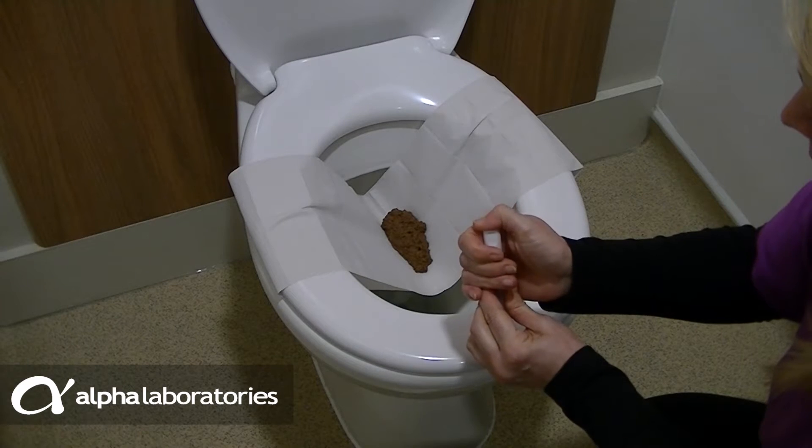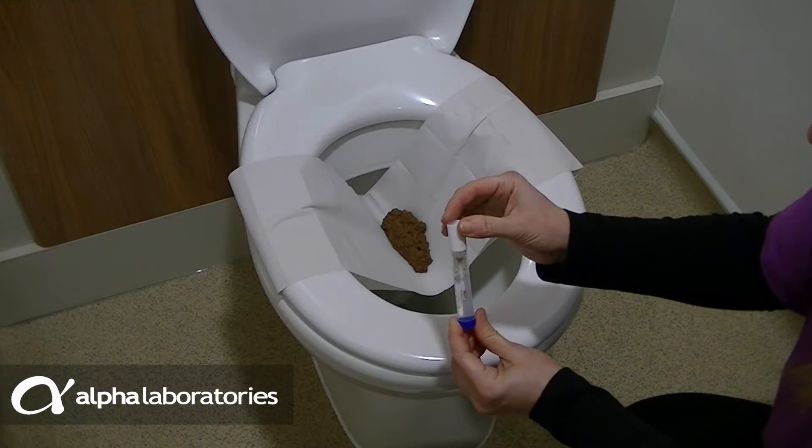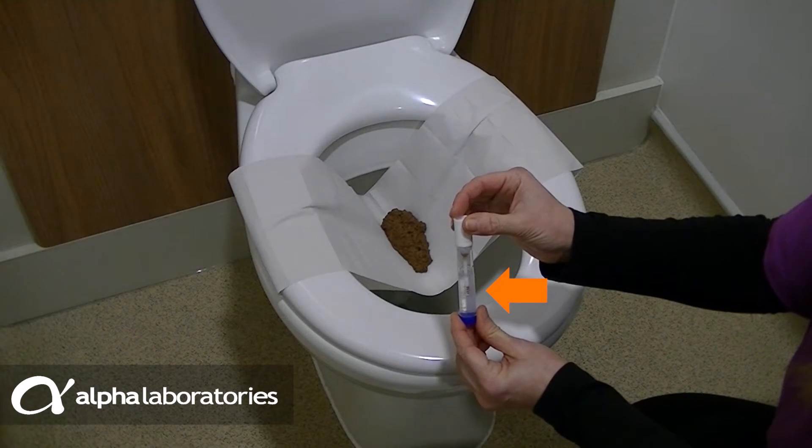Push the white cap firmly into the locking position. You will feel and hear two clicks. Excess faeces will be trapped by the collar and only a measured amount will be placed into the buffer.